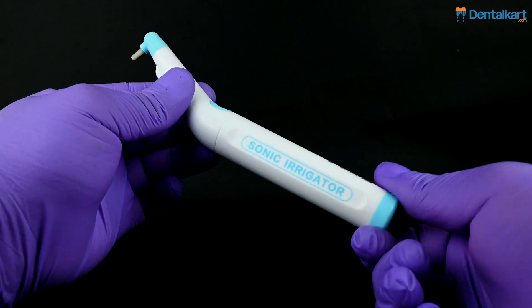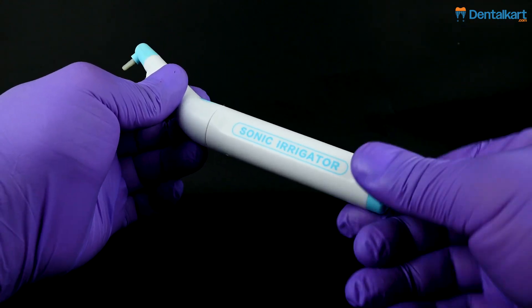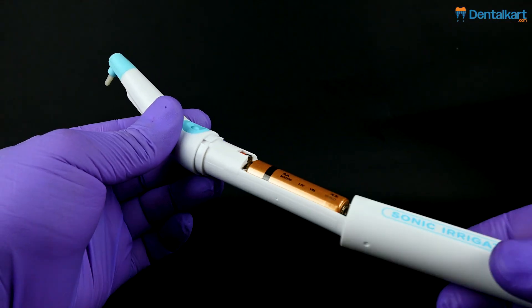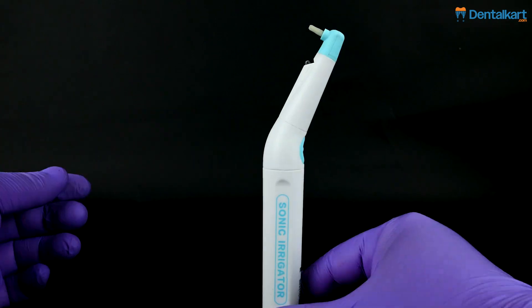Preparation: Twist the base of the sonic irrigator counterclockwise to loosen the upper handle, then gently remove it to insert the double-A battery. Once done, place the handle back and twist the base clockwise to secure it tightly.